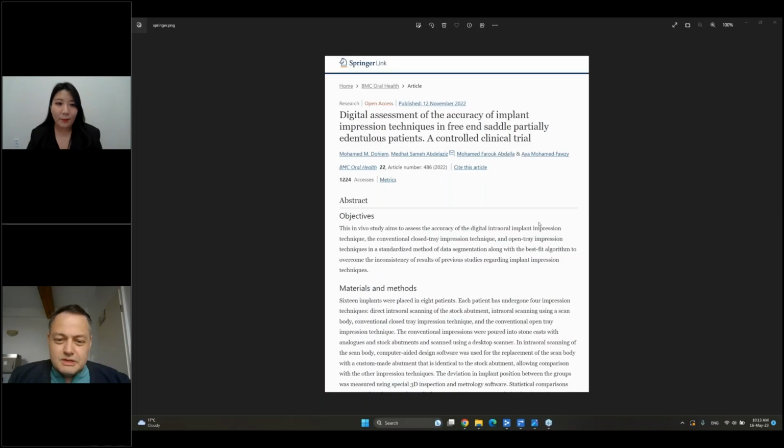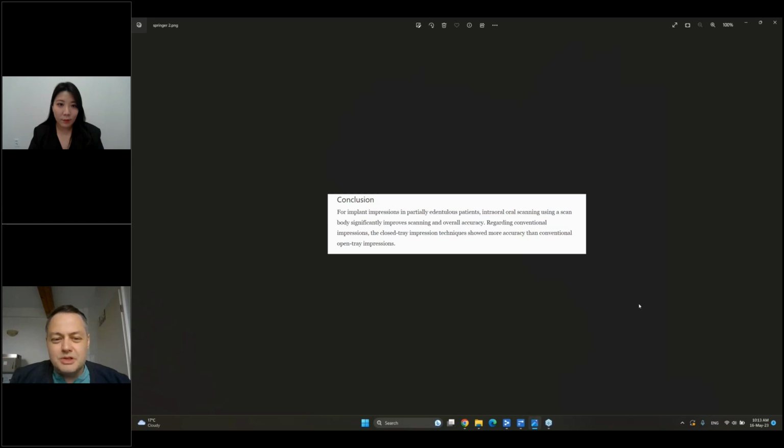Yes, so I would like to say that I'm actually very happy to see that in the industry and in the online media, like for example in Springer, more and more articles show up that actually show the digital dentistry. And I'm going to share my screen now to show you that digital dentistry is more accurate now than impression techniques in closed tray and open tray. And I hope more and more studies would show up, and this would become the mainstream. We would only take digital impressions for such cases.